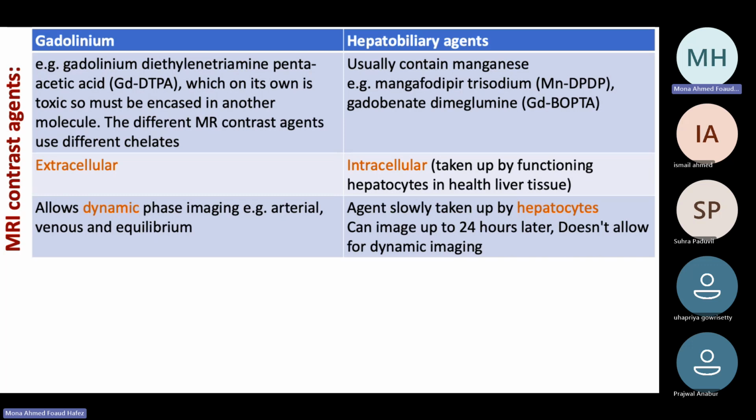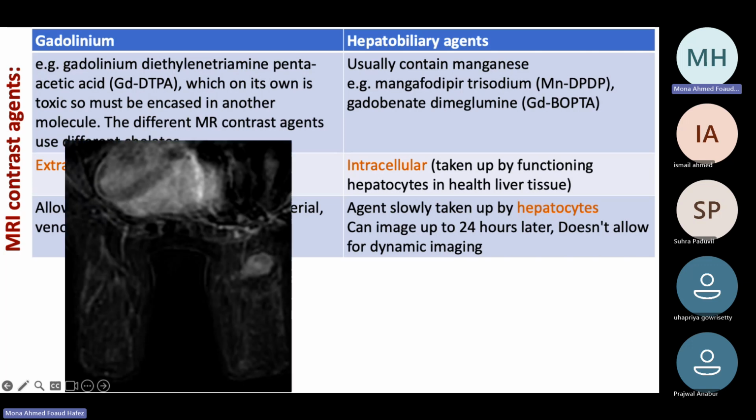It is mainly extracellular in the blood vessels, does not enter the cells, and can be imaged dynamically in arterial, venous, or equilibrium phases. I think this is breast cancer and heart showing the contrast.